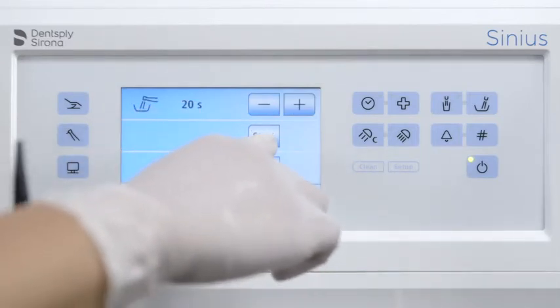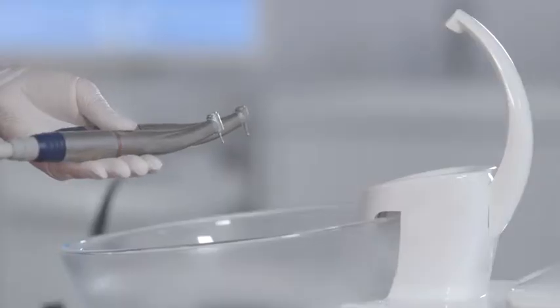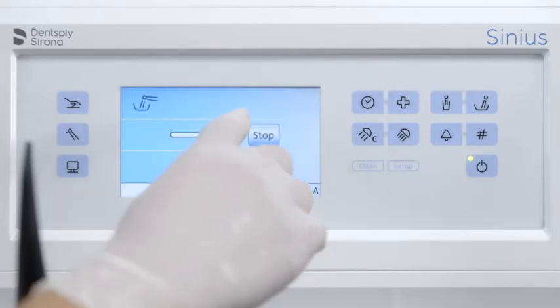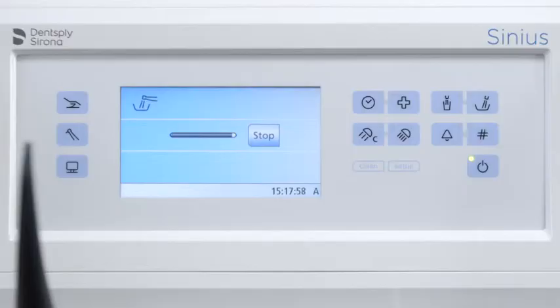Use the purge function to flush the instruments after every patient. Hold the instruments over the cuspidor and press start. The instruments that are taken from the holder are flushed for the duration of the set time.